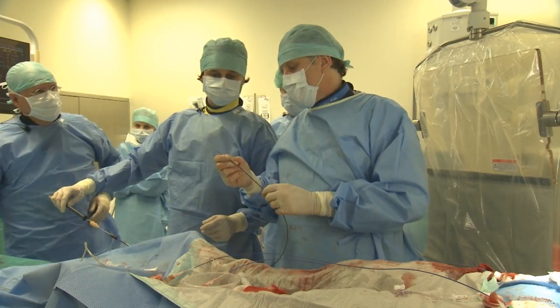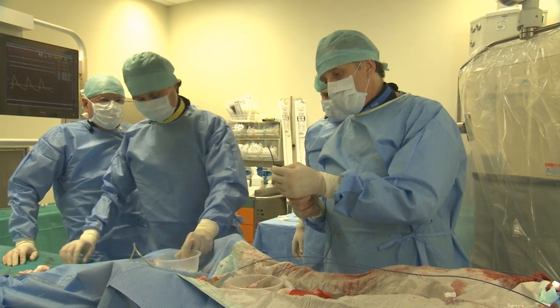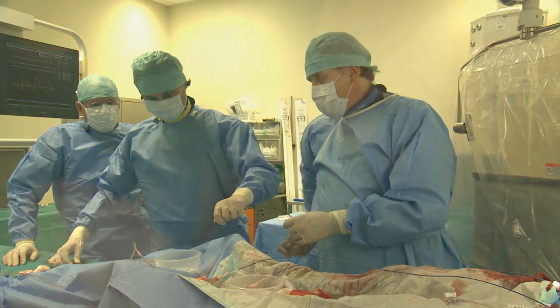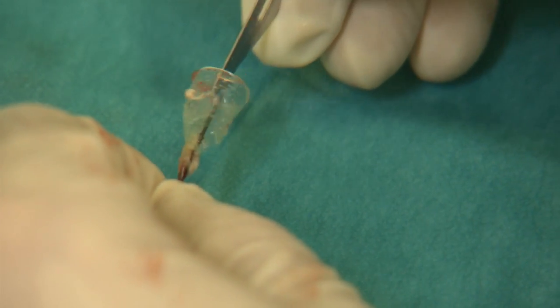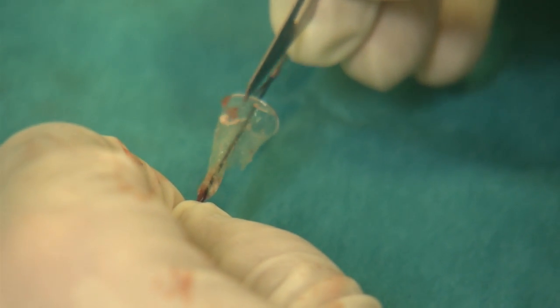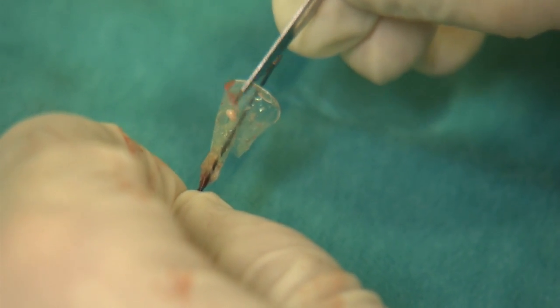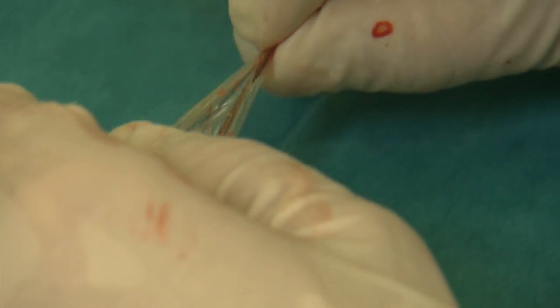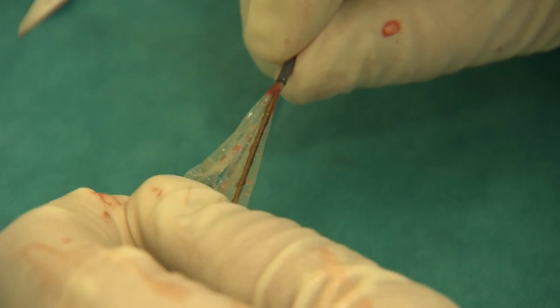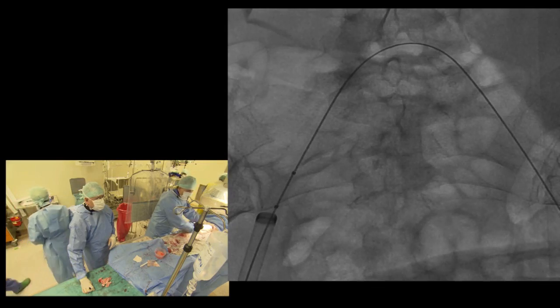We remove now the Claret system from the patient circulation, and now we try to see if there are any emboli or tissue particles. And now let's take a look at the distal filter, distal part of the device. We can appreciate at least one large particle, which is actually this huge, and many little debris in the bottom part of the filter. Check out the proximal part of the device. Here we can find many little particles which are located in the membrane, and at least another one large clot or debris. That it is a very safe approach to avoid excess of bleeding.